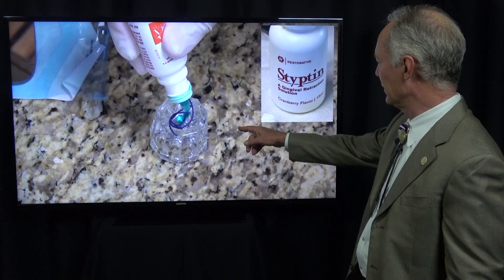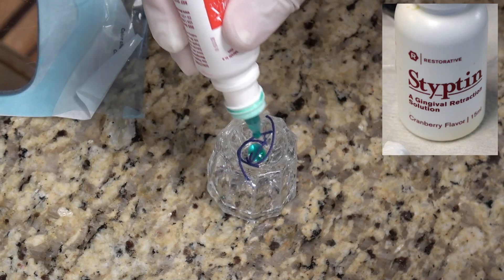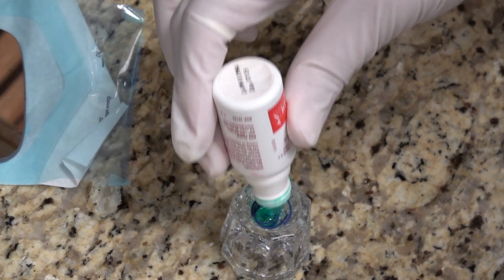We're placing them in a solution of Styptin, which is a gingival retraction solution that controls bleeding. So we're soaking the cords in this hemostatic agent.